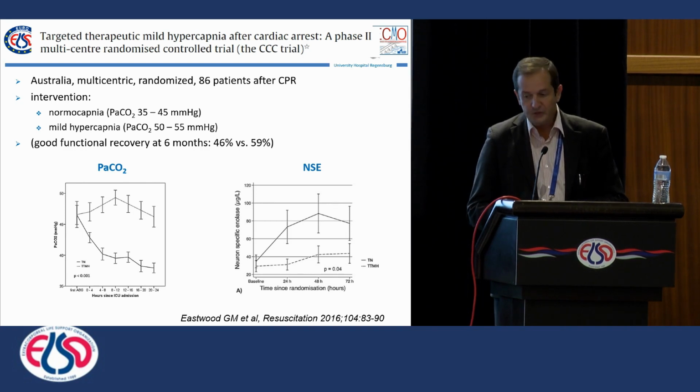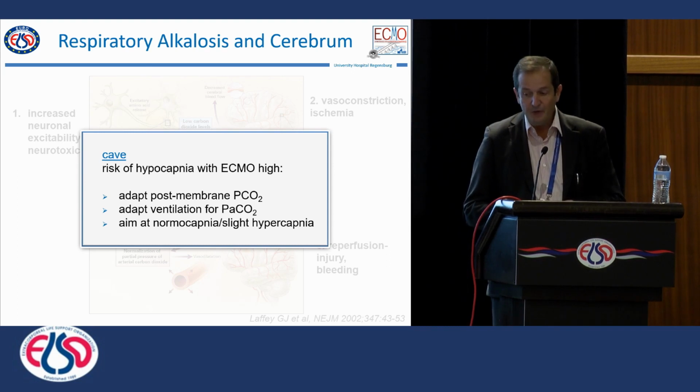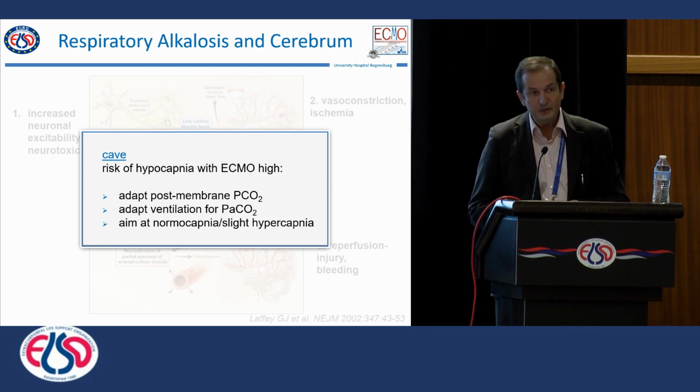So my suggestion today would be: the risk of hypocapnia with ECMO is very high. The risk is really exceedingly high. Therefore, immediately adapt your post-membrane PCO2, adapt your ventilation for PaCO2, and aim at normocapnia or even slight hypercapnia.